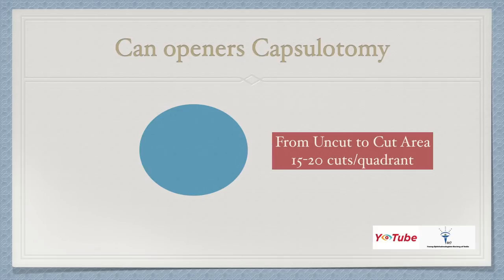The next step is the can-opener capsulotomy or any method to tackle the anterior capsule. One should first learn can-opener capsulotomy before moving on to continuous capsulorrhexis, because any time you have a problem you can always convert to can-opener. This should be done from uncut to cut area, giving about 15 to 20 cuts per quadrant. Learn can-opener first, then go for capsulorrhexis. A good can-opener with 15 to 20 cuts per quadrant is almost as good as a circular capsulorrhexis.